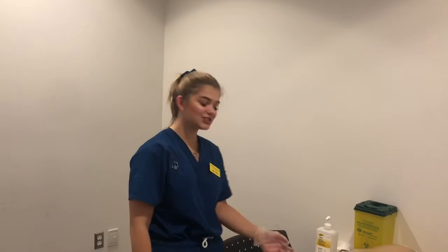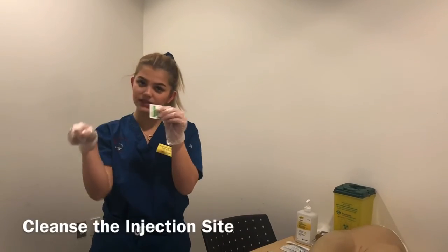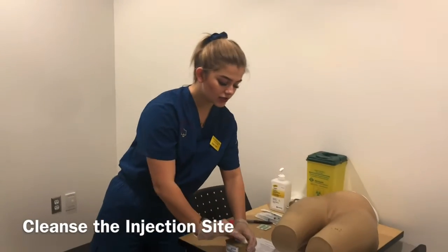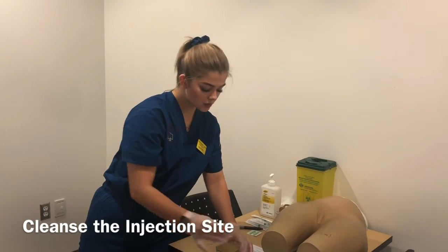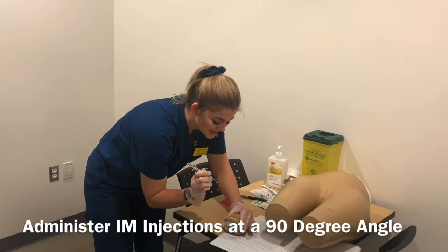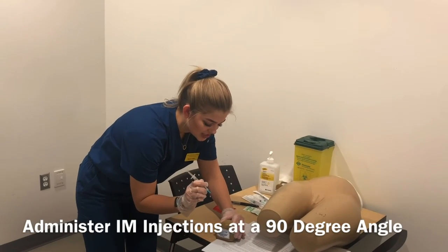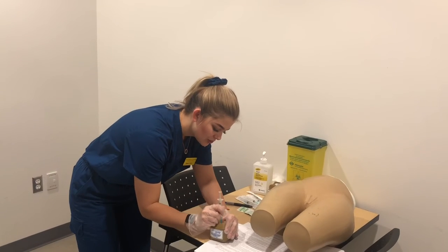Okay, so before administering medication again, I just want to make sure I get an alcohol swab. We're going to pretend that I'm opening it right now, and you're going to swab the area of the skin where we're injecting it onto the deltoid. Let it dry for 15 to 20 seconds. Okay, Mr. Mancini, I'm preparing to inject the medication into you. You're going to feel a slight pinch in 3, 2, 1.